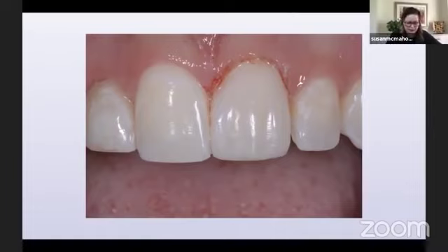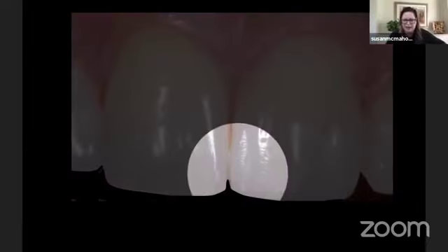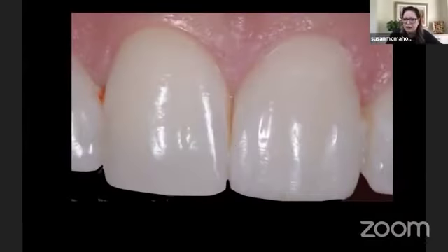And so that's immediately pre-op. And here she is at her post-op appointment 3 weeks later. So you can see how it still leaves all of those little cross lines in it. And the light reflects off your composite the same way it does off your natural teeth. And you also see how it builds out those line angles. So if you want to hide a composite and you want a composite that nobody can see, and do composite like a rock star would, then you need to finish like this, right?